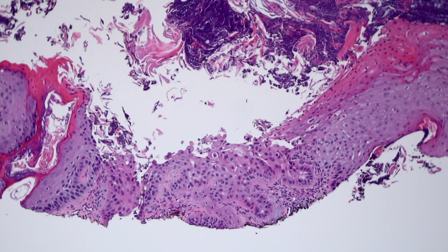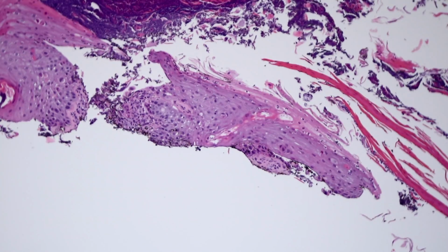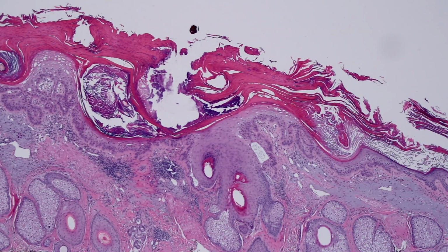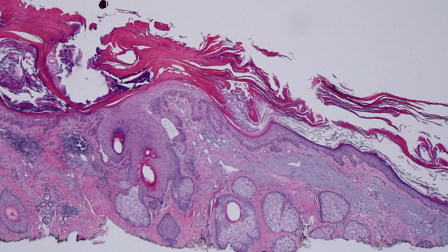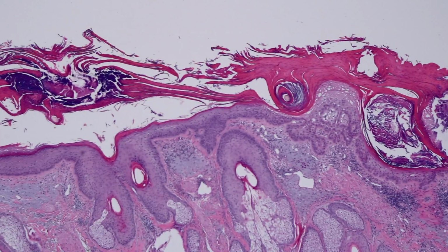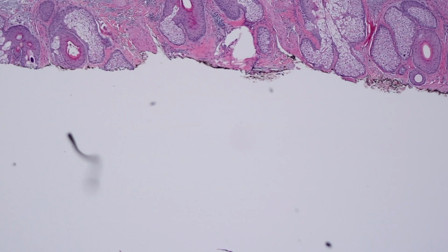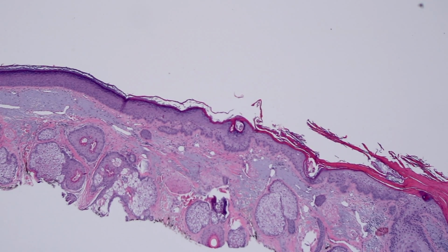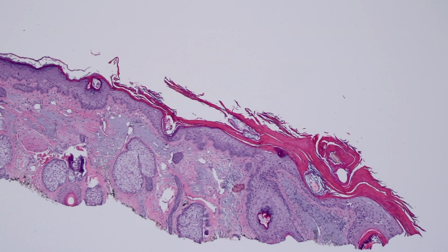I try to avoid using this, but sometimes there's just no way to decide for sure because I can only comment on what I can actually see in my biopsy. And that's again why it's important to have a good rapport with your dermatology colleagues to find out what terminology works for them, what way they like you to phrase things when you're having trouble deciding or figuring out what's going on. And always, of course, to encourage them to call you if they have a problematic case where, hey, we really need to know what we need to do next to figure out the situation. That's just a general good rule in all of dermpath and really in all of pathology.